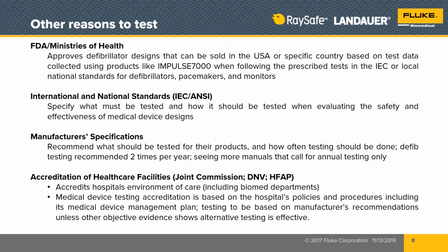Here are some other reasons to test. The US FDA and ministries of health around the world are looking at these same statistics and incident reports. There are international standards for minimum performance and safety of medical devices, including defibrillators and AEDs, where they have to be proven safe and effective for clinical use.